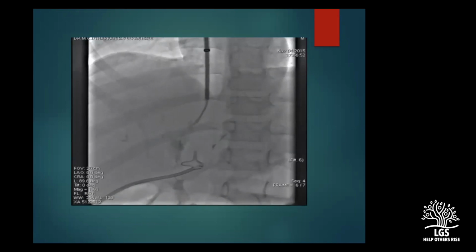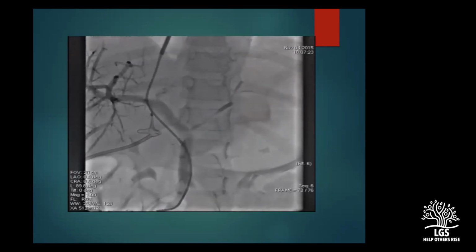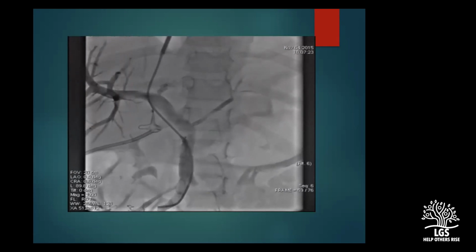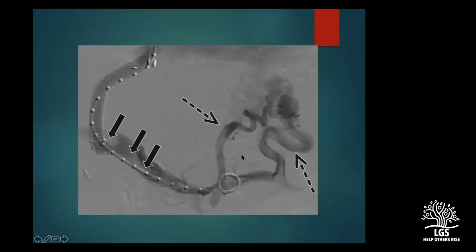This is the other technique wherein you directly puncture from the cava towards the portal vein. If we are lucky, we can just hit the portal vein, and this is how it looks. And I think this is what we used in this particular child for doing DIPS procedure. And we balloon the track like we normally do. We measure it, and then we deploy the stent.